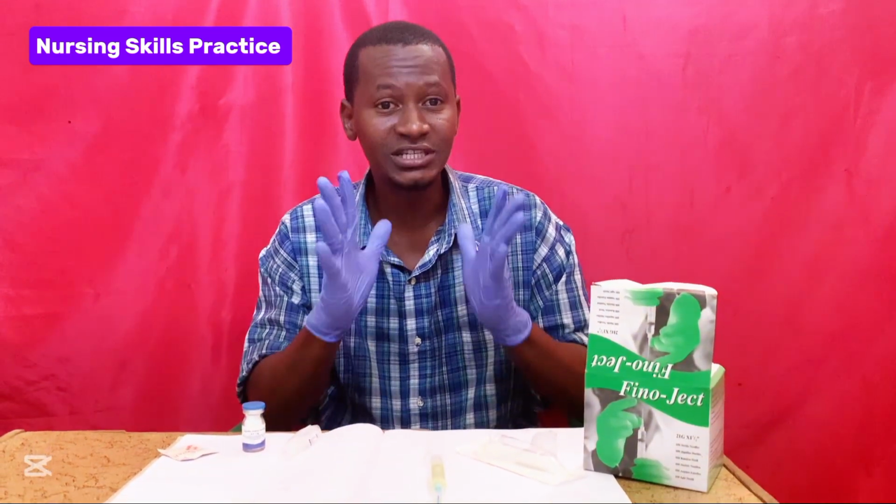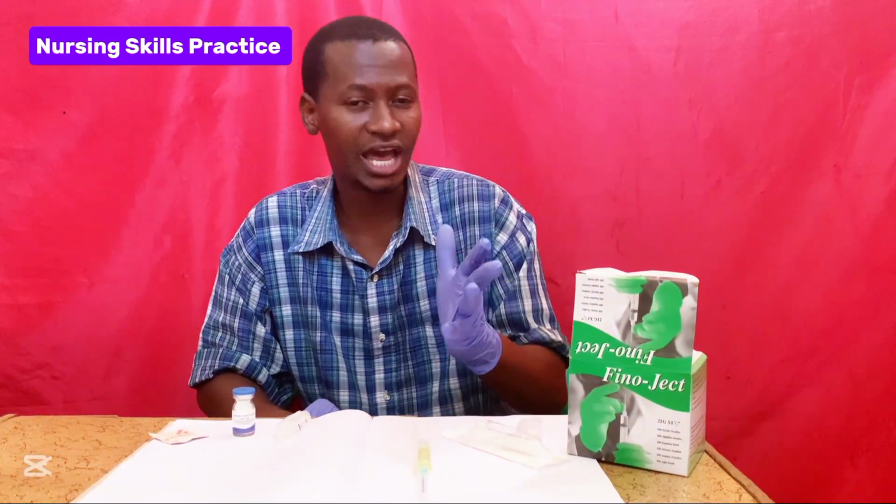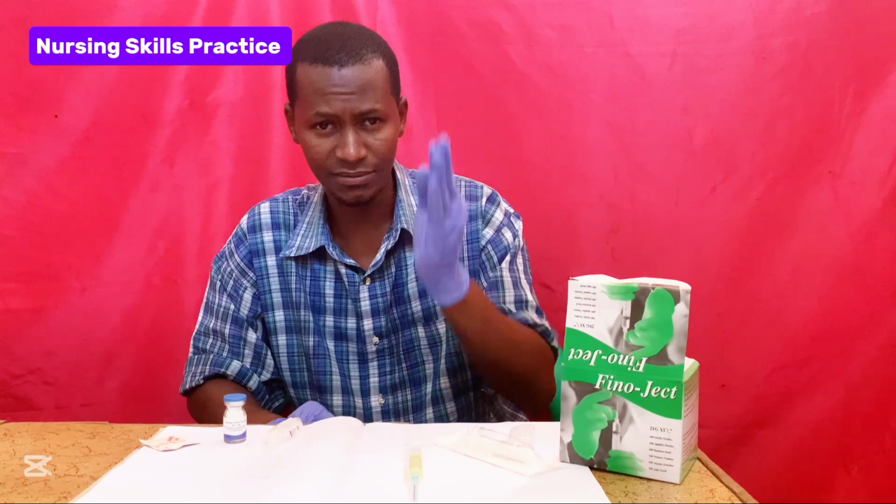Now you can administer the drug safely to the patient. Make sure you follow the advice of drug administration. That is right patient, right drug, right dose, right route, right time, right reason, and the right documentation. Once you finish diluting, ensure you administer the drug to the patient immediately.